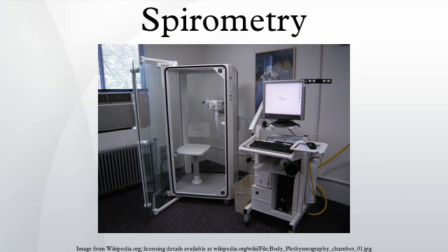Maximum voluntary ventilation. Maximum voluntary ventilation is a measure of the maximum amount of air that can be inhaled and exhaled within 1 minute. For the comfort of the patient, this is done over a 15-second time period before being extrapolated to a value for 1 minute expressed as liters per minute. Average values for males and females are 140–180 and 80–120 liters per minute respectively.